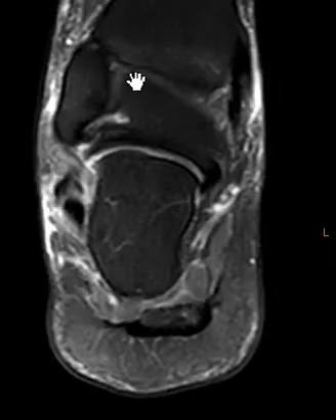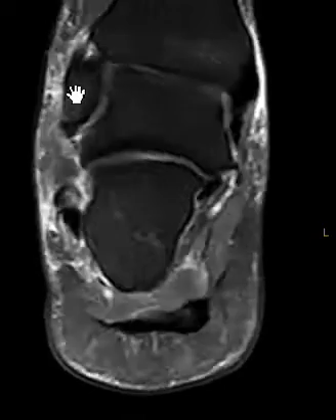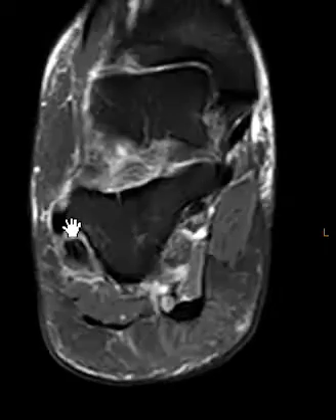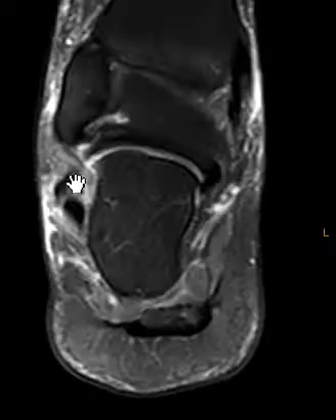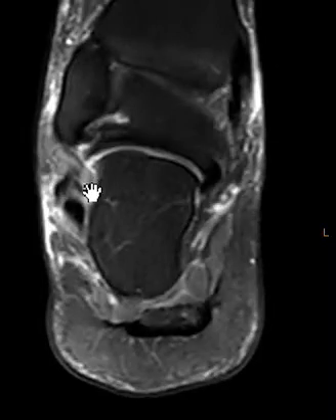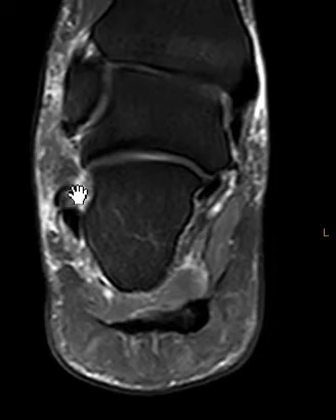One last view here. Now we've kind of switched sides — this is the fibula, and here's the lateral side. We're going to follow this down and we see abnormal signal here. This is actually the peroneus brevis tendon, which has a partial tear visible on this view. It should be nice and round, but it looks like an upside-down V. This is a partial longitudinal tear of the peroneus brevis tendon that shows up better on this view.